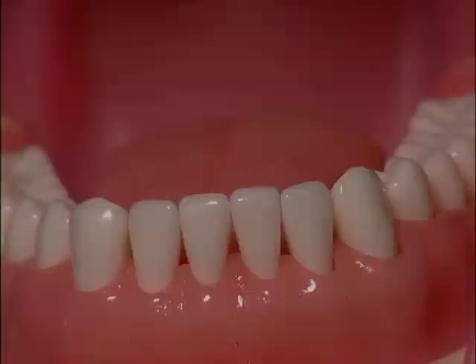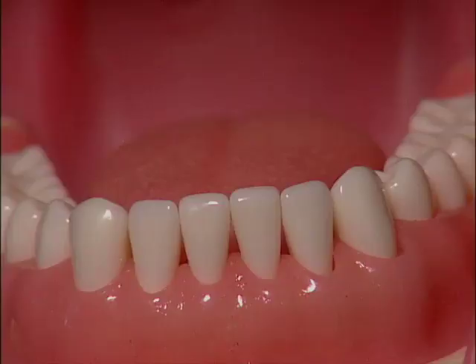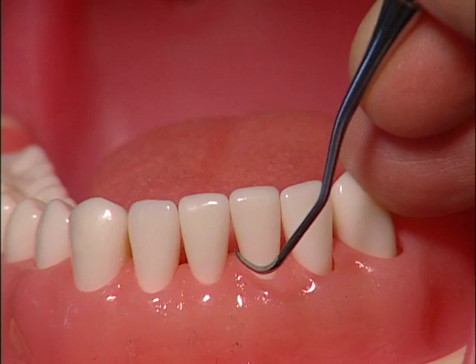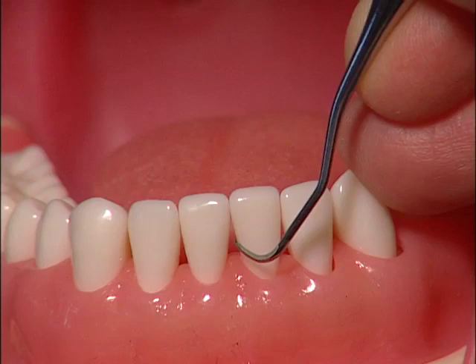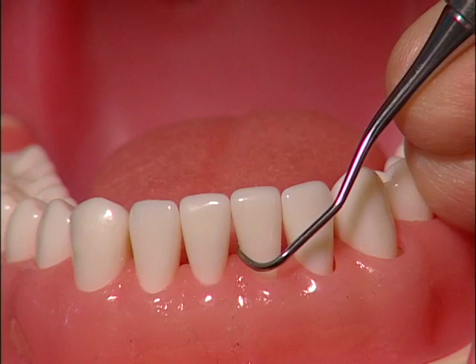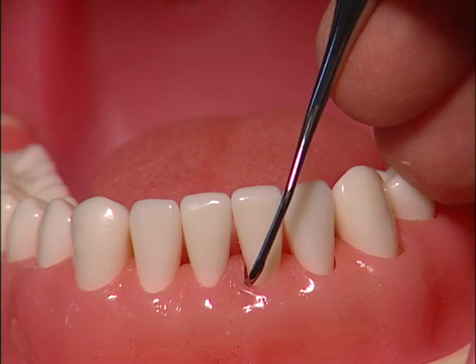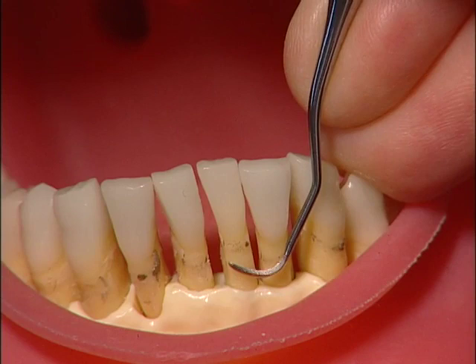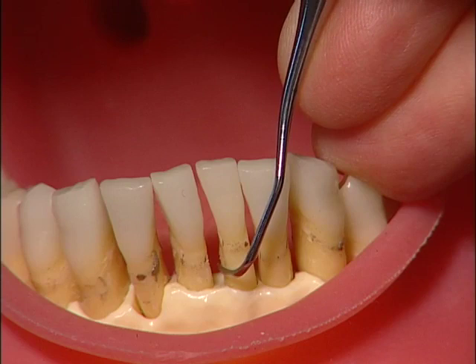For this technique practice, work on the mesial surface of the mandibular right central incisor. Aim the toe of the working end toward the mesial surface, as this is the direction in which you will be working. Place the working end in the get-ready zone, then gently slide it beneath the gingival margin to the base of the pocket. Adapt the toe third of the cutting edge to the tooth surface, imagining that you are locking the toe third against the root surface. Make controlled strokes across the facial surface, rolling the instrument handle at the mesiofacial line angle to maintain adaptation. Continue strokes until you work at least halfway across the mesial surface.